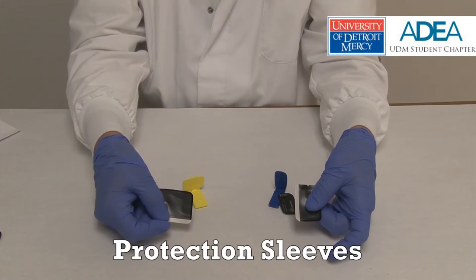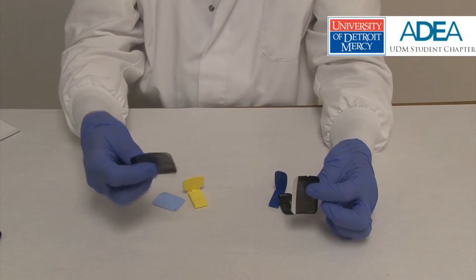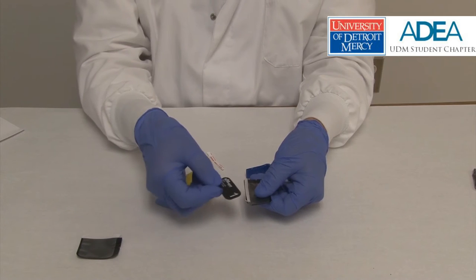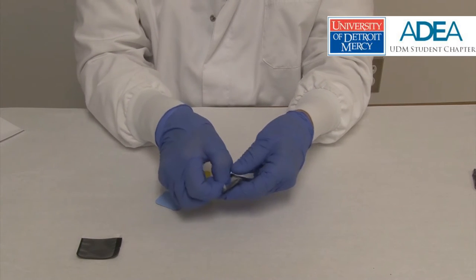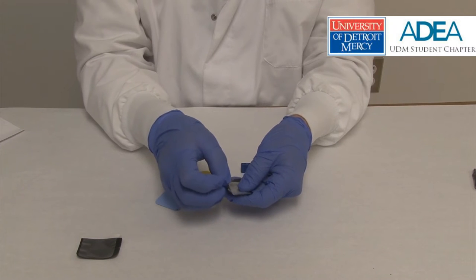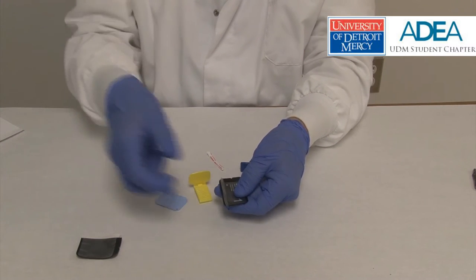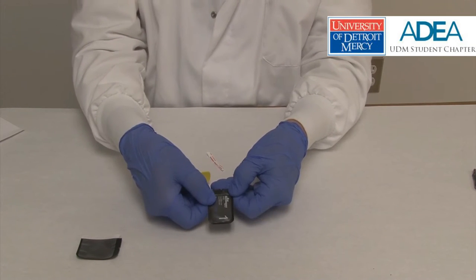These are the protection sleeves. They are sized narrow for number one and wider for number two. The sensor plate is placed face down in the sleeve. The adhesive strip is exposed, and the envelope is sealed.